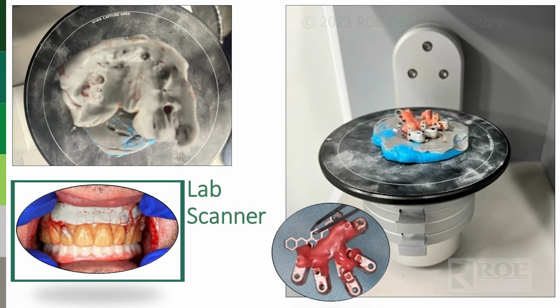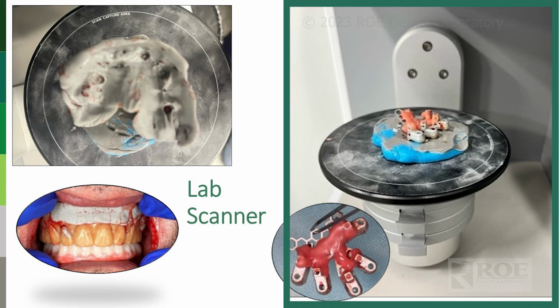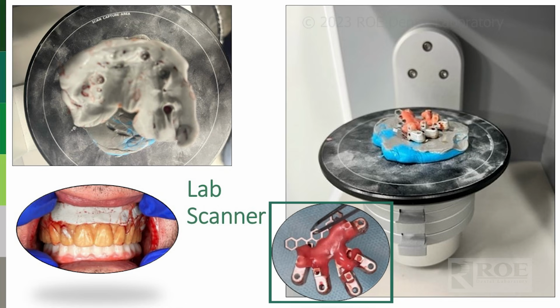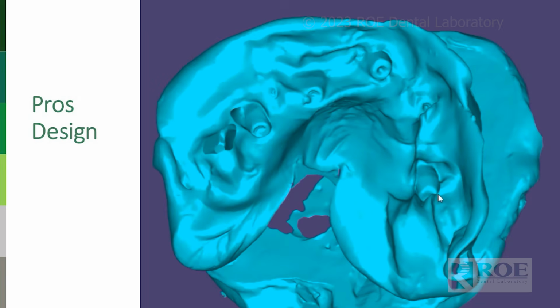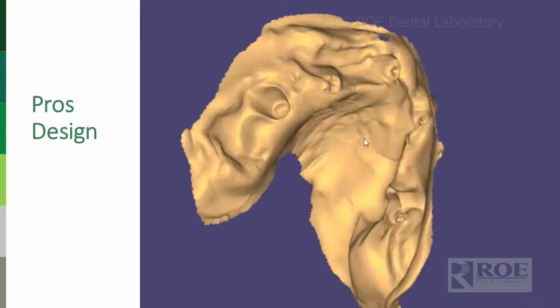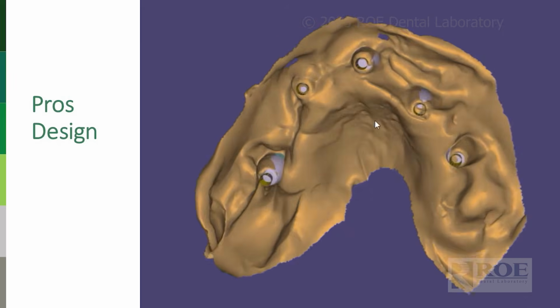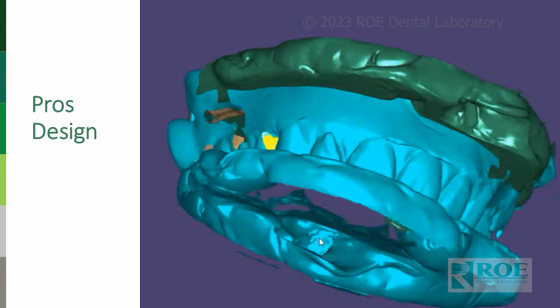He placed the denture inside the lab scanner. He placed the OptiSplint inside the lab scanner. And based on scanning the OptiSplint, he's just micrometers away from accuracy, from capturing that on the multi abutments. So really nice process here, the scans that he sent to us. And then based on these blobs, which don't look like blobs to us, we align everything together and make him a prosthesis, just like that. And then he prints it in office.